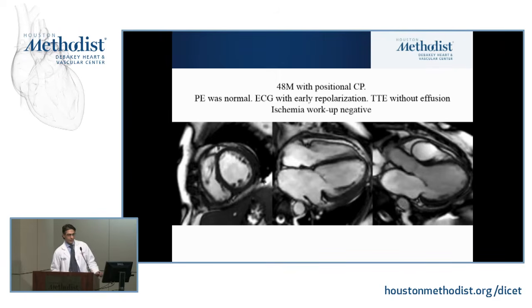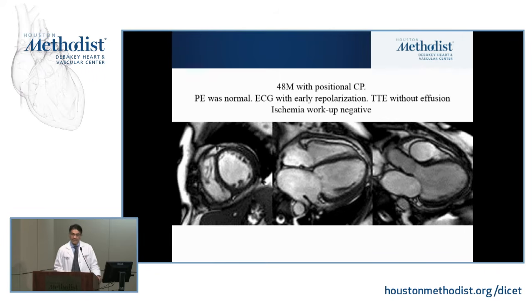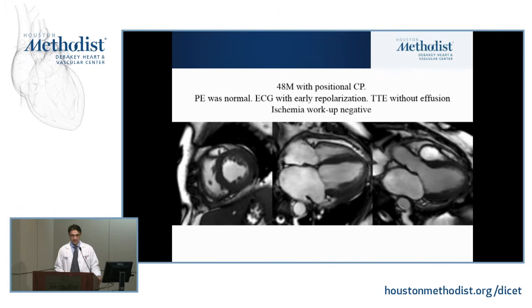Well, here was a case, 48-year-old, positional chest pain, physical exam normal. He didn't have any rub. EKG really showed what I thought was early repolarization. I didn't feel there was any PR depressions or ST elevations. And echo did not document an effusion.